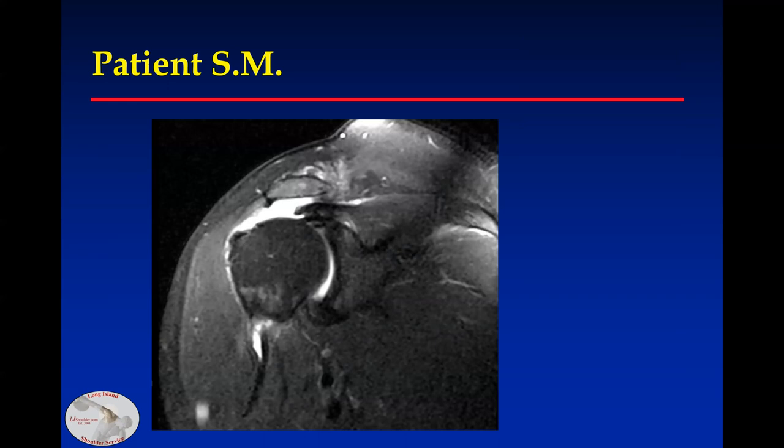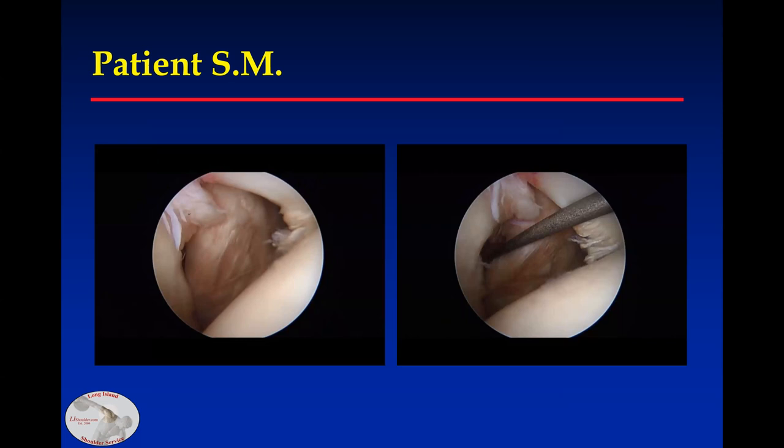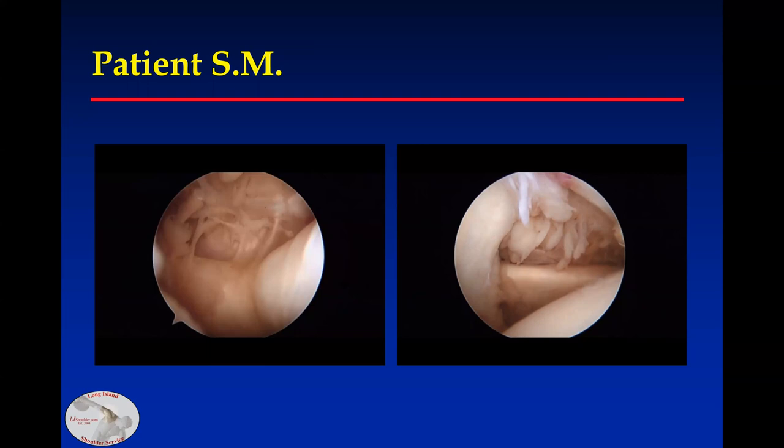This is a typical posterior superior tear, but on the MRI, if you go a couple cuts anterior in this patient, you'll see the comma tissue, and often fluid medial to the coracoid. This is the patient at arthroscopy viewed from the posterior portal. You can see the comma tissue, the rolled edge of the subscapularis, and when you pull on the comma, it brings the tendon into the more anatomic position.